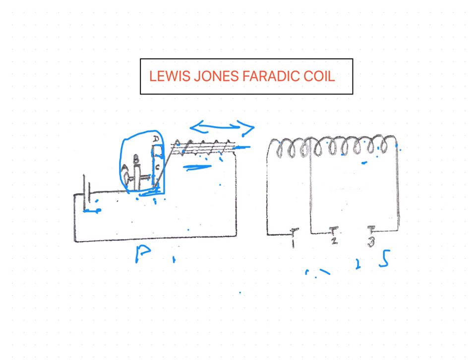Three terminals are connected to the secondary coil, one to each end and one a third of the way along.